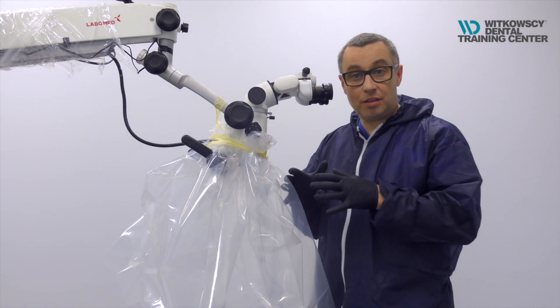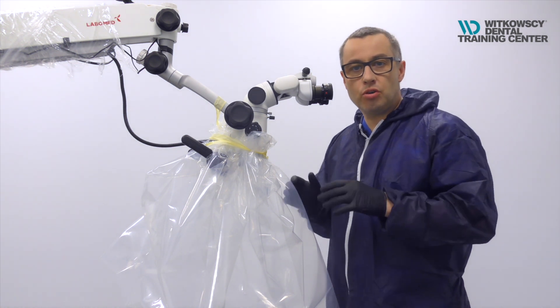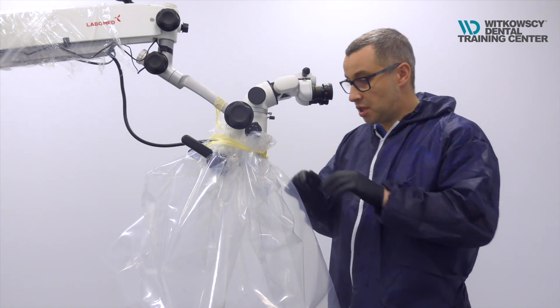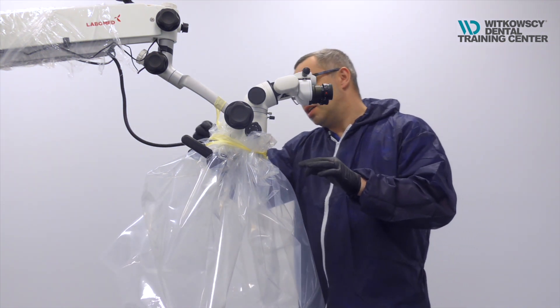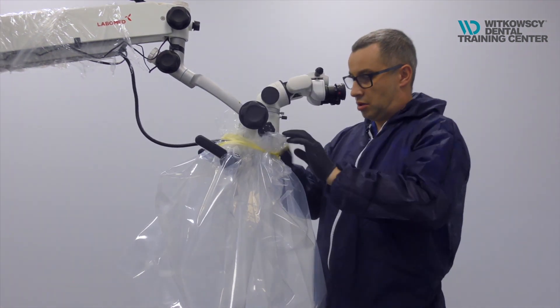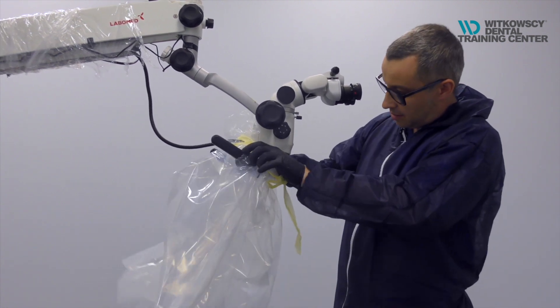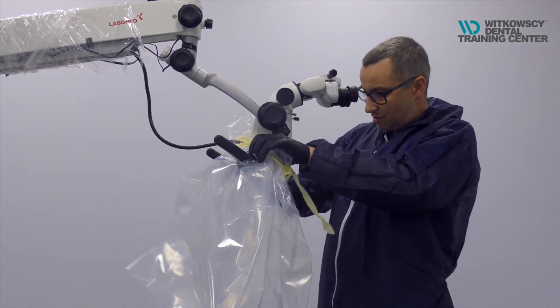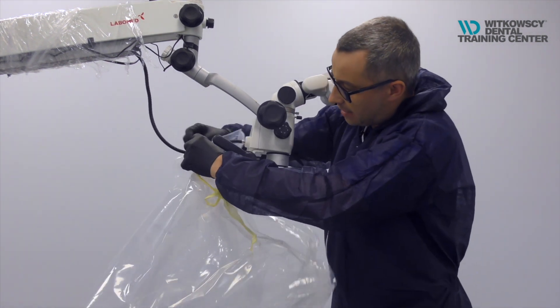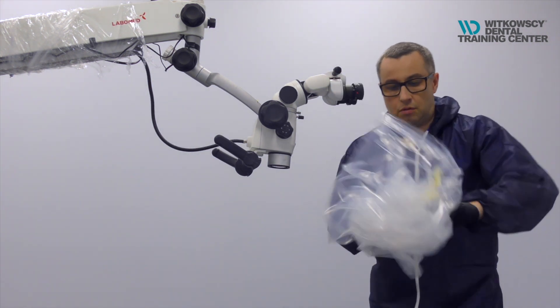Now you know how to build this plastic tent over your microscope, how to position the microscope, and how to work safely. After the patient leaves the office, discarding the tent is really easy. You just take the tape off, remove the tape, and then — without touching the inside of the tent — you remove the tent and throw it away.